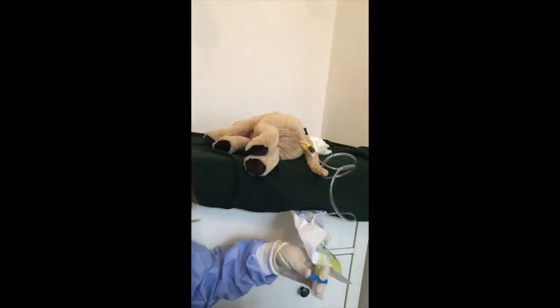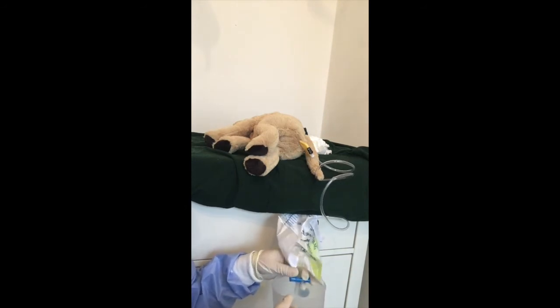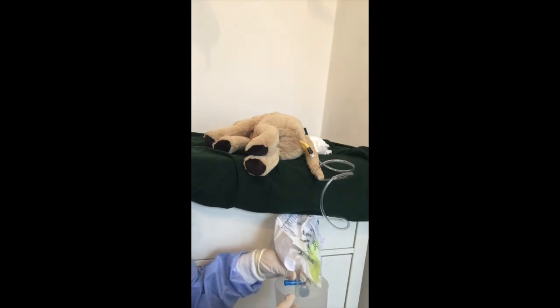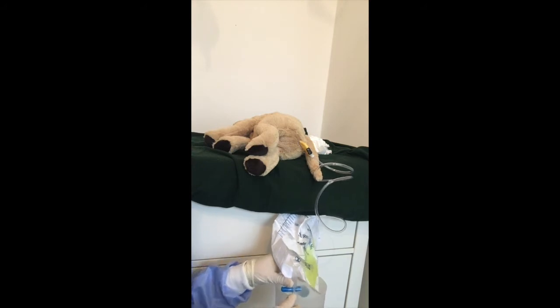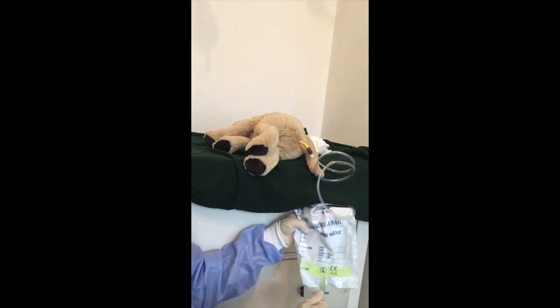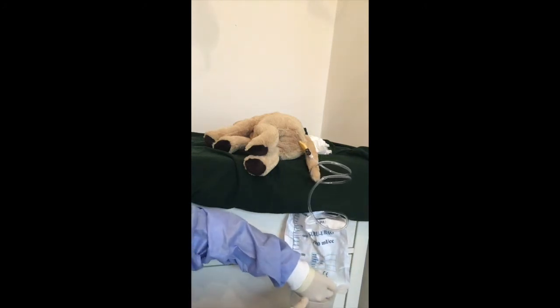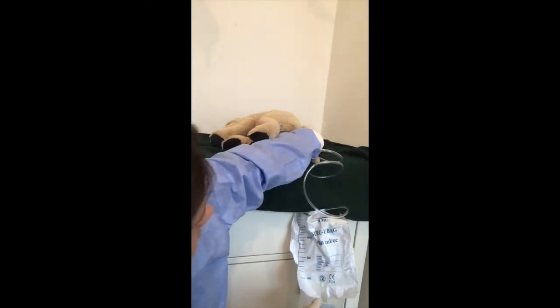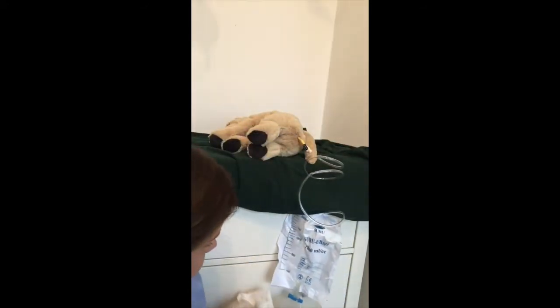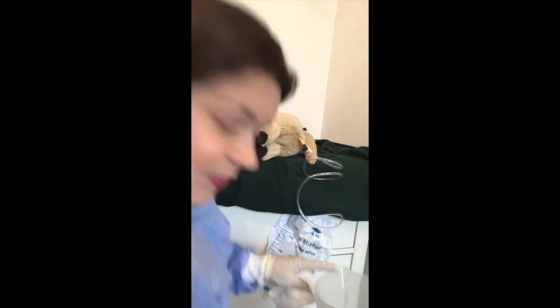So I'm going to lift this up so you can see it. This bag's technique is literally pop it to the side and it opens, and it's trickling in already. I'm going to hold it to make sure that everything comes out — a little shake — then close. I'm going to make sure that's clean.